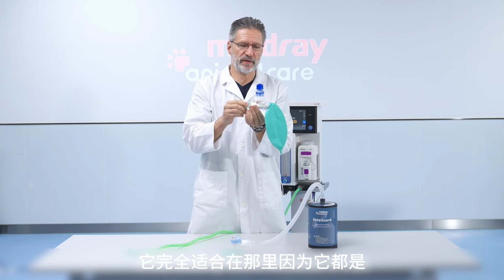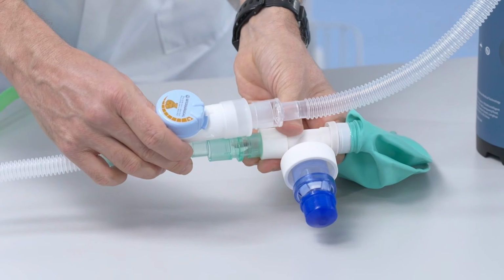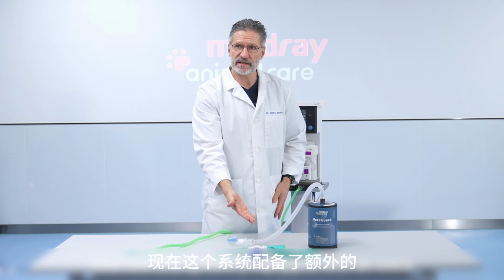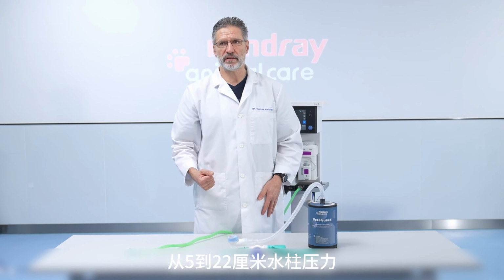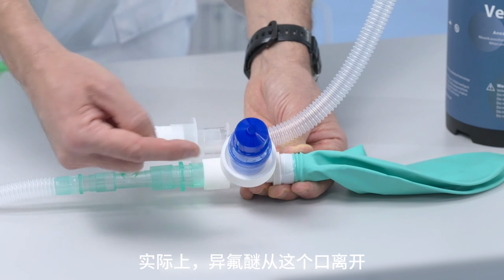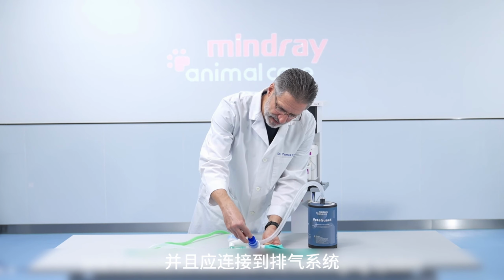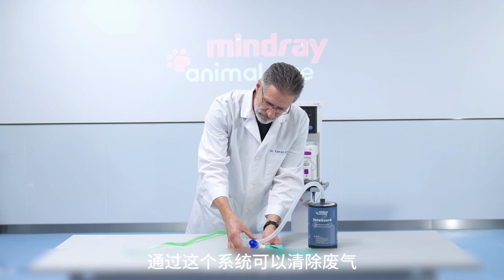Okay, it fits exactly there because it's all 22 mm standard. And now this system is equipped with an extra pressure relief device which is adjustable between 5 to 22 centimeters of water pressure. In fact, isoflurane exits at this port, but I have another cup device that can be attached here, and it should be attached to a scavenging system. So scavenging the waste anesthetic gas is possible via this system.